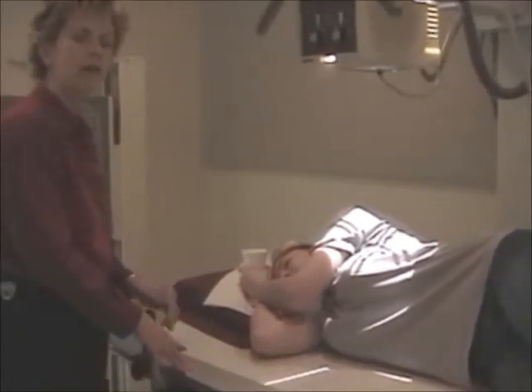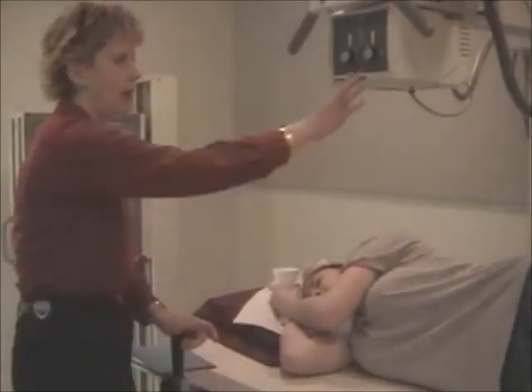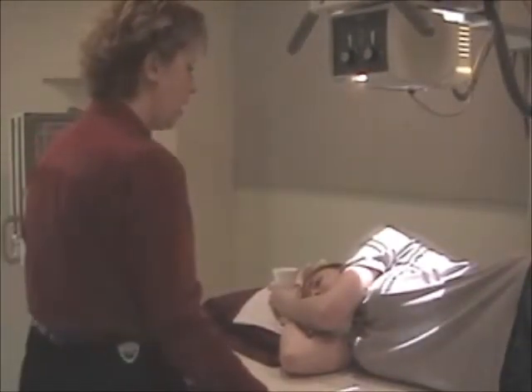Then think back to what I said a few minutes ago. Where is the esophagus? Where is the esophagus in relationship to the spine? It's just anterior to the spine. So we're going to slide the tabletop towards me. And I'm going to look at the patient's body, and there's their spine. That would be the mid-axillary line. You know that from your thoracic vertebrae and your lumbar spine vertebrae exposures. And then the esophagus is just anterior to the spine.